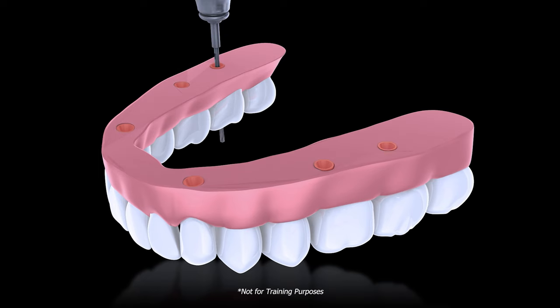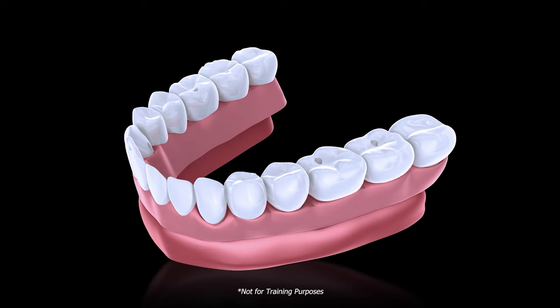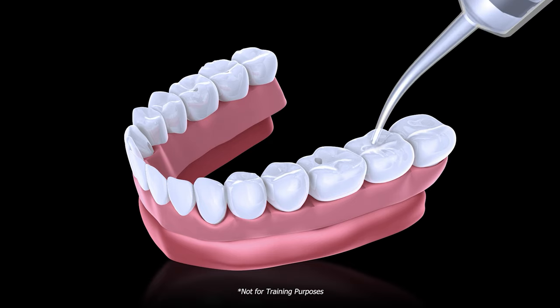For screw access, create pilot holes through the occlusal surface. Expanding screw access is easy — our guided drill won't damage the seating surface of the prosthetic screw. Our hand reamer gently removes any residual plastic inside the tie base. Torque screws to 15 newton centimeters, then obturate the screw holes and verify the occlusion.